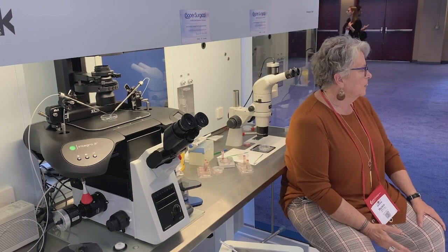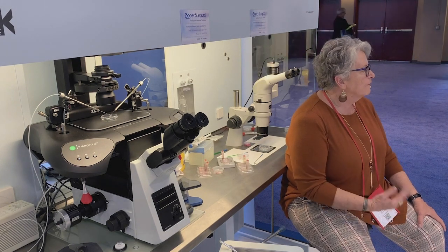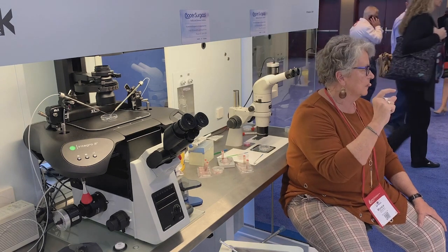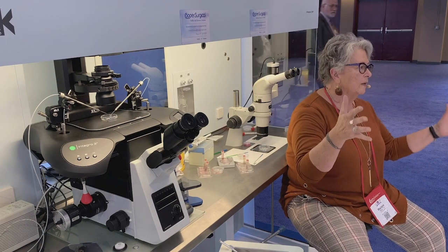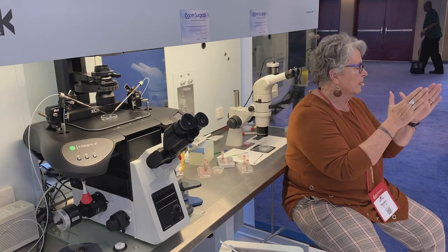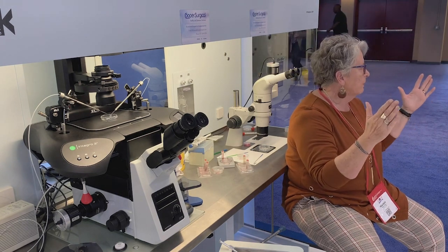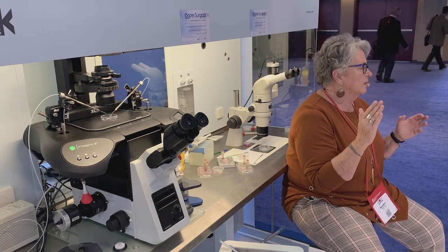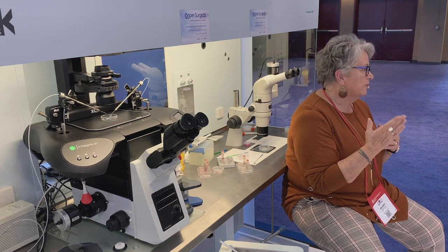For us, when we started making decisions about what we were going to do with blastocysts, the first thing we did was sit down and measure the response of our blastocysts when we put them in the equilibration solution. So we put them on our big inverted scope, and then we measured how quickly they shrank and how quickly they re-expanded. So we knew where they started. We wanted to get them back to that point at the end. So we said, how long does it take for an embryo to do that? So we found it ran about 6.5 to 7.5 to 8 minutes.